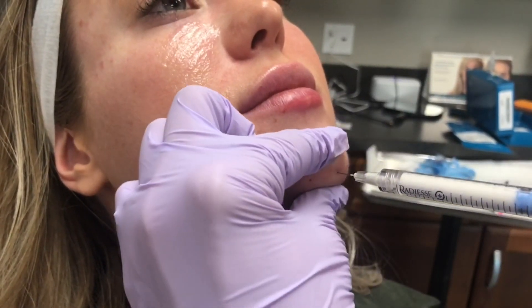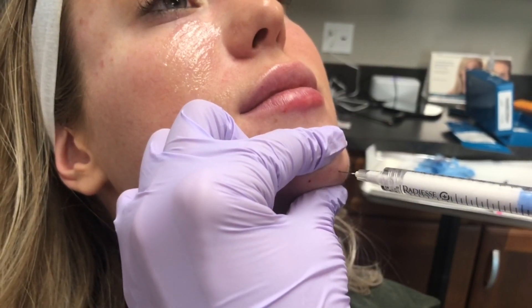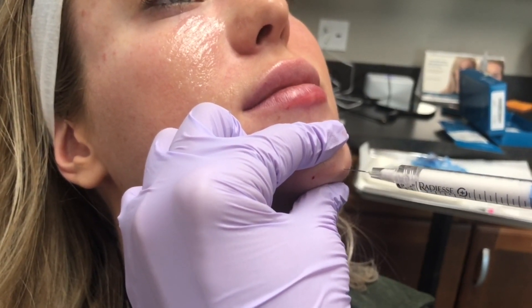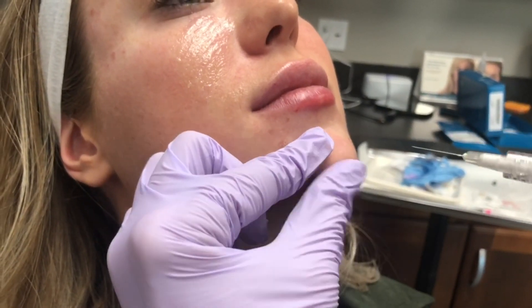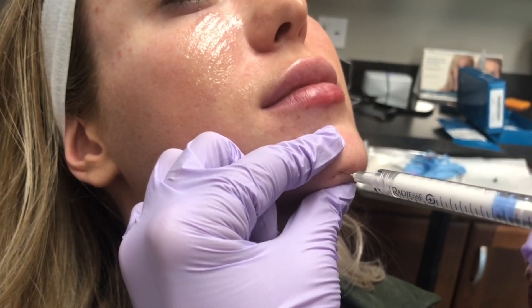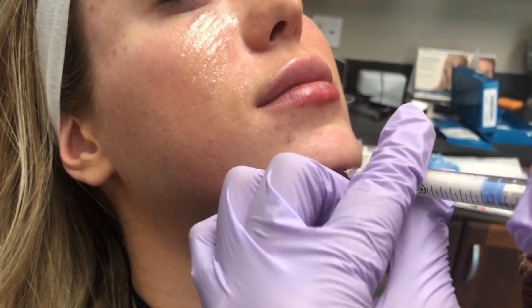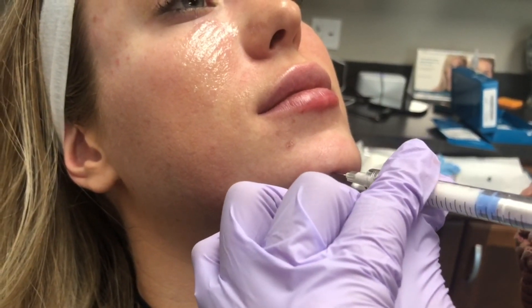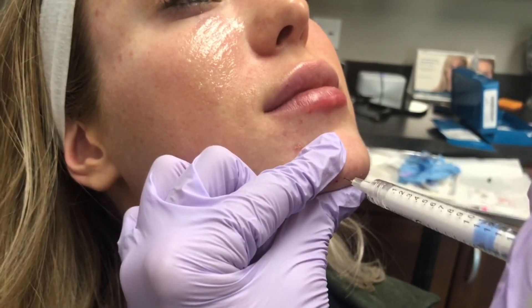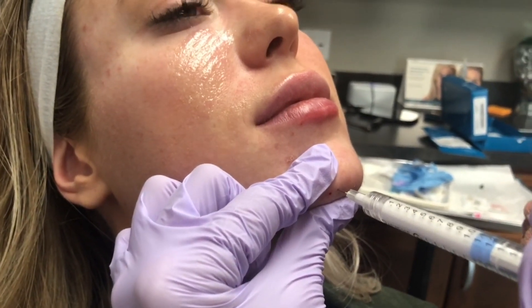It looks like we're going straight in the center of that chin, where she's going to require a little bit of additional filler. The patient was numbed for about 15 minutes with a topical BLT-like anesthetic, and she's tolerating it very nicely. Radiesse Plus also has lidocaine in the filler, so as you work, the patient is going to become a little bit more numb with the lidocaine that is in the product.